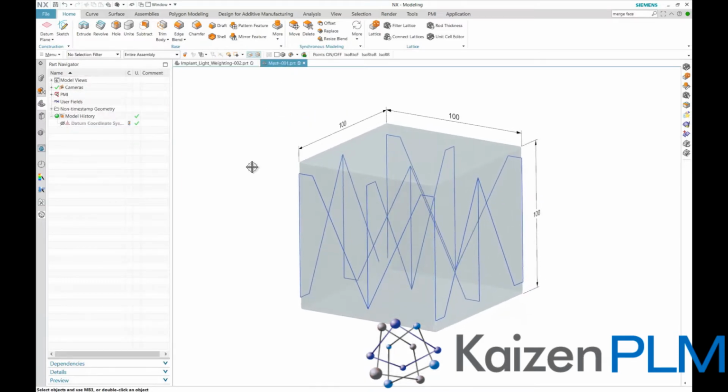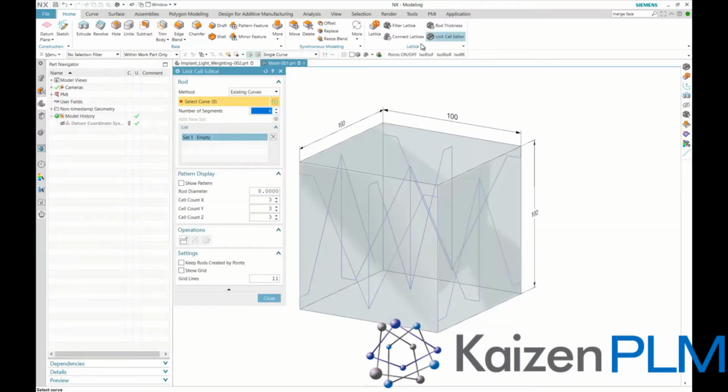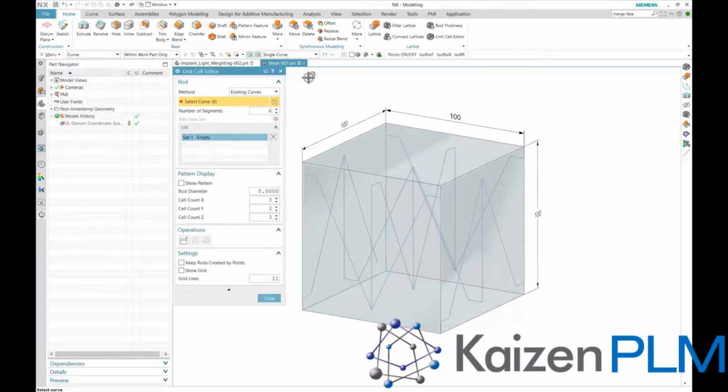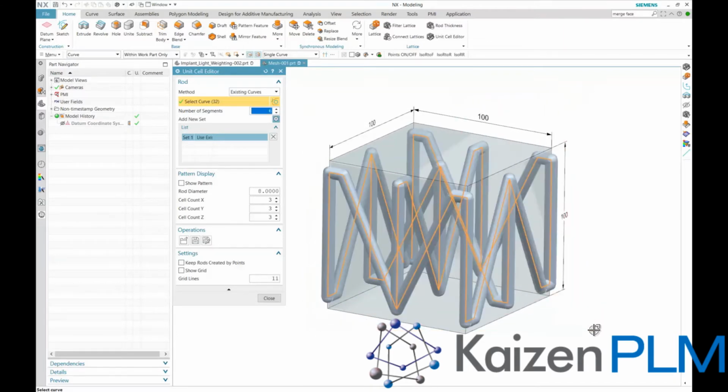The process to create your own lattice cell unit is extremely simple. Here we have made it even easier by using an existing part containing curves to define the custom lattice cell unit. In the part, the defining curves have been created inside a cube 100 by 100 by 100. By utilizing the unit cell editor and setting the filter to select curves only, we quickly define the custom cell unit.